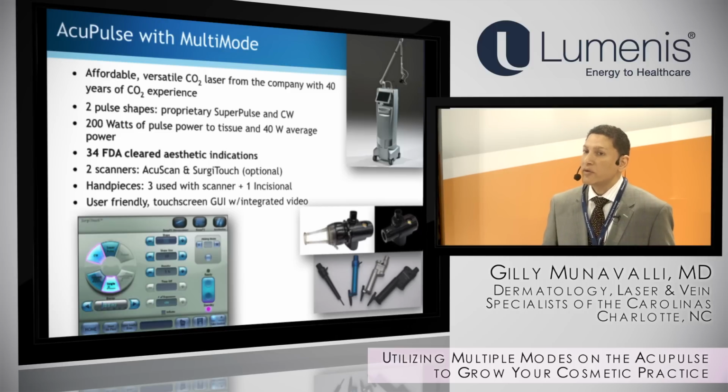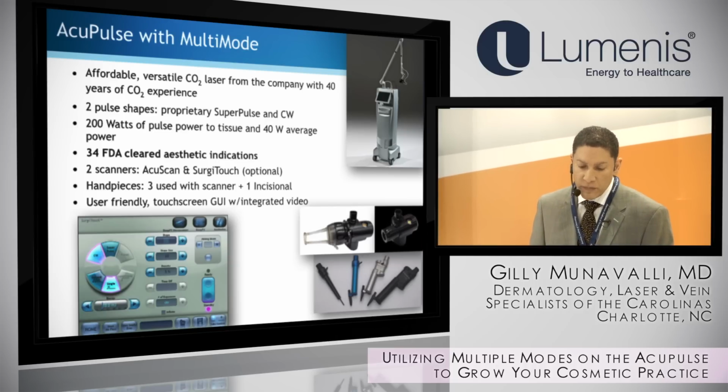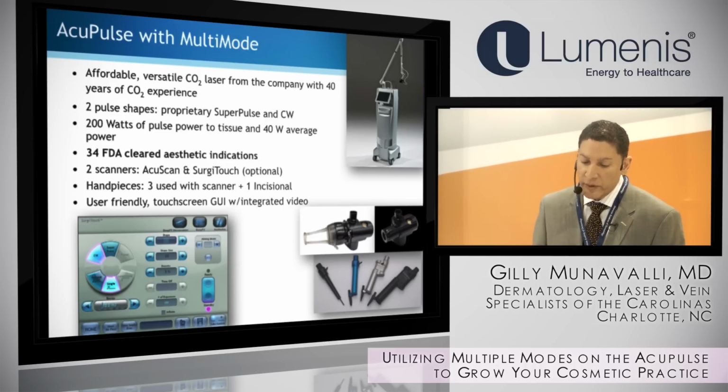So right off the bat, you've got the UltraPulse, which we have as well, which is at one price point. But the AcuPulse can function very well, as I'll show you, using the SuperPulse mode, even though you're not getting the same peak power, you're still getting histologically the same response. And then I'll talk a little bit about the handpieces and what's involved with that.